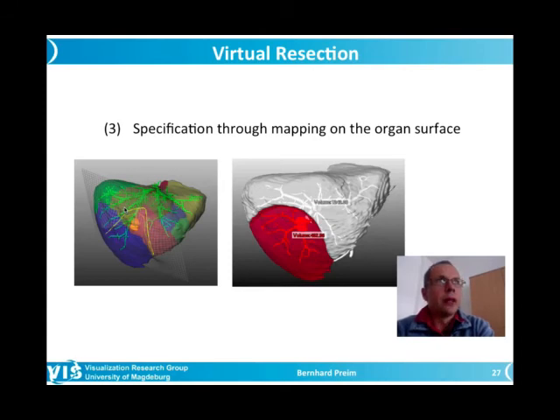And then the question is, of course, what is the influence of such a displacement? This could be a very local influence. That means we had a plane before, now we move one point and we go high up steeply and steeply descend afterwards, then the influence would be very local. It could also have a larger or even a global influence, meaning that basically all points of the plane are a little bit moved in this direction.